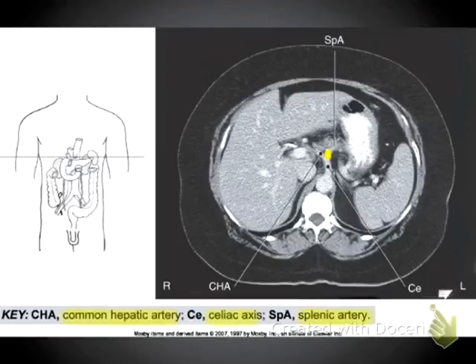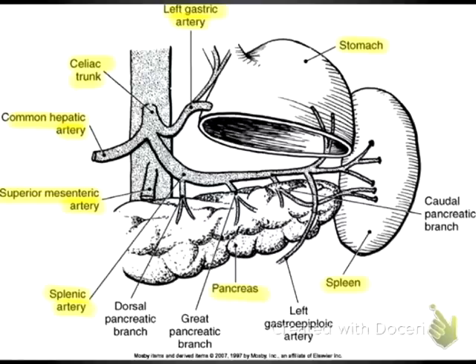We also see that we have the bifurcation here and here. And so we have the splenic artery coming this way and the common hepatic artery coming this way. We don't actually see the left gastric artery on the bifurcation. We also do see that we have the stomach here, the body. We do see some of the rugae here. And we do have the falciform ligament there for the liver. And I believe that is it for that image.